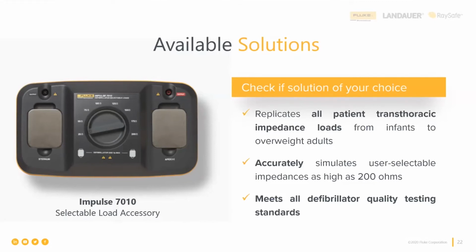You know, when we were in CPR class last night, it made me stop and think. I got 4 children here. My youngest child is 18 months, and we're doing pediatric CPR. And as we're going through the class and covering AEDs and such, the discussions revolve around the differences between child and infant CPR versus adult CPR. Will your AED, or will the defibrillator, respond appropriately when you have that infant with such low resistance? On the infant, you're running the pads from the front of their chest to the back, to the middle of their back. The resistance is much lower. So are you getting the appropriate energy discharge?